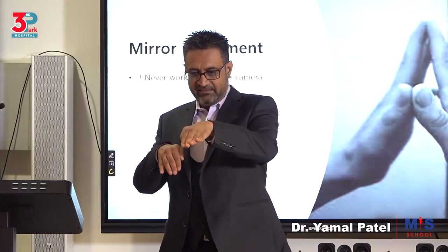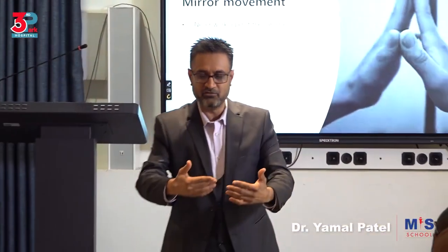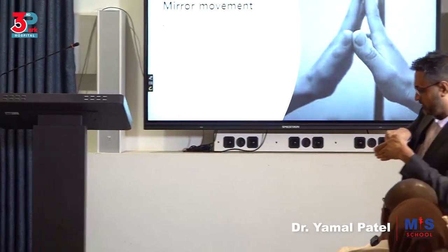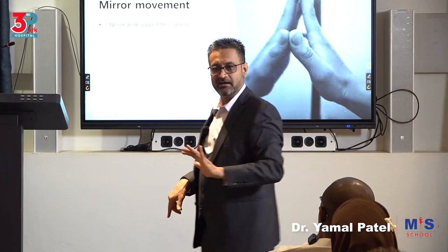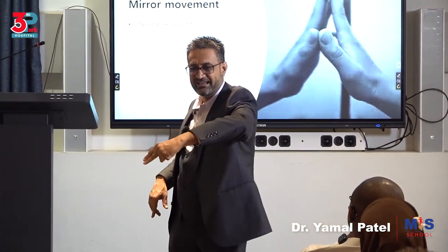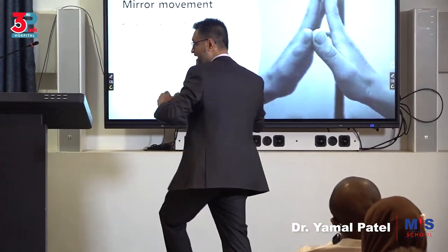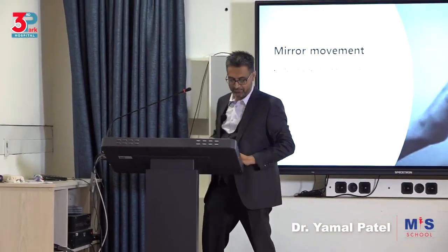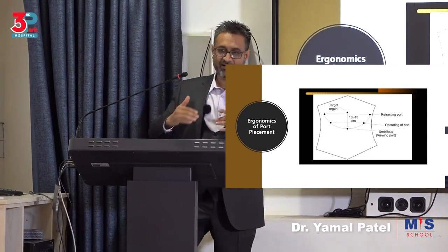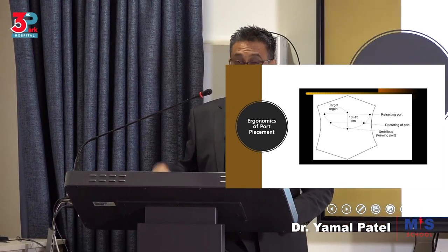So if I'm seeing this way and I'm working this way, that's working along the camera. You've understood? If I'm seeing this way and I come with a port with an instrument this way, it doesn't matter how good a surgeon I may be, I'll have a challenge trying to grasp because I'm moving against the mirror. So you'll have a problem when moving against the camera. Port placement, ergonomics.